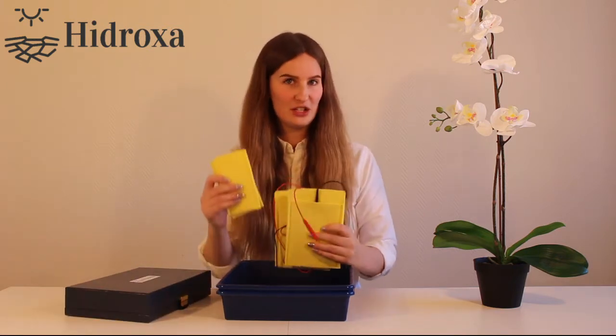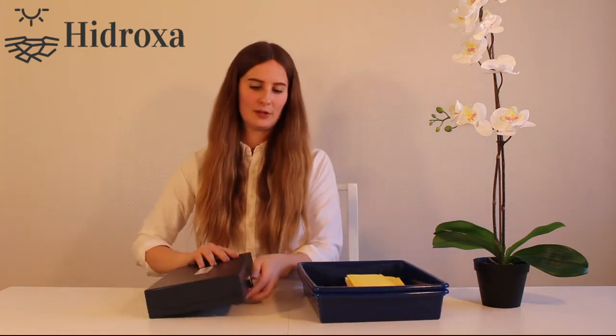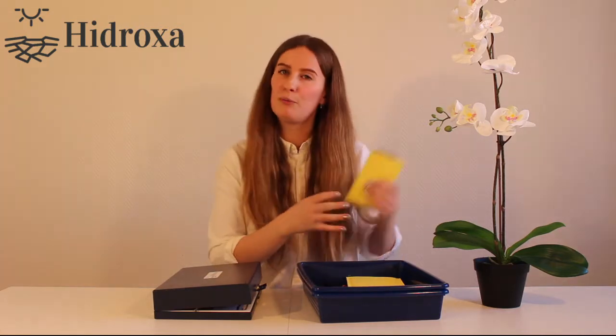Start by unpacking your equipment. Inside your box you will find our device Hidroxa SC20, two pairs of electrodes in two different sizes, and two plastic containers. Inside the device you will find a battery charger and two blue straps. The blue straps and the smaller electrode pockets are used to treat the armpits — I will put them aside for now.